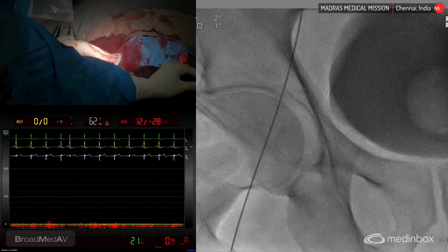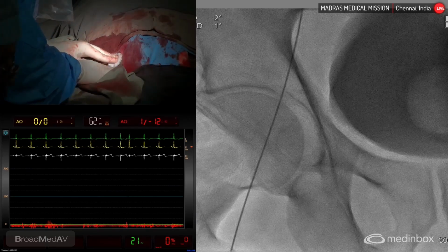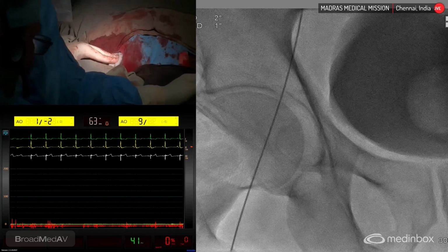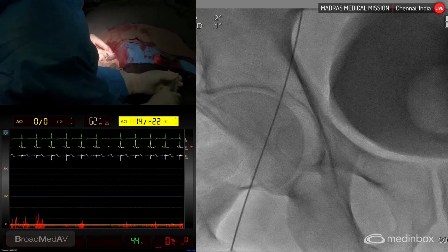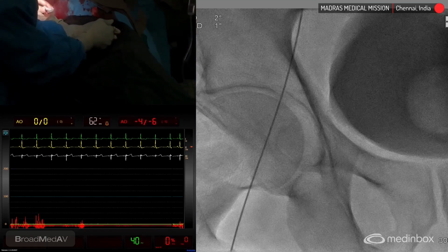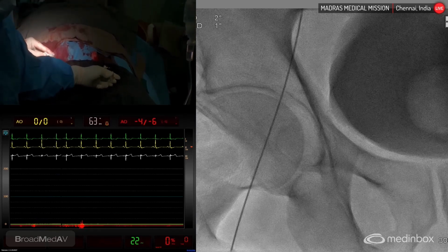Yeah, wire is there, not to worry. Okay. One flush. Okay, so now we can feel the pulse. Give me contrast.